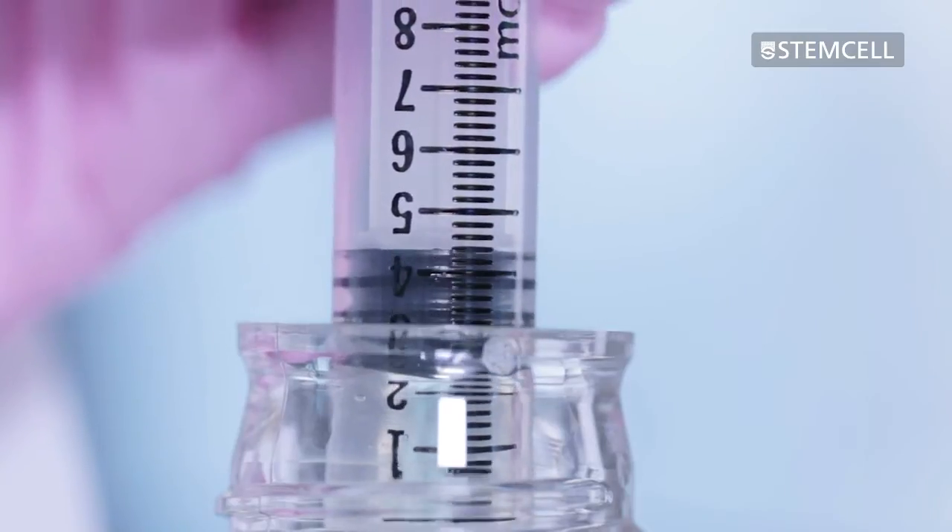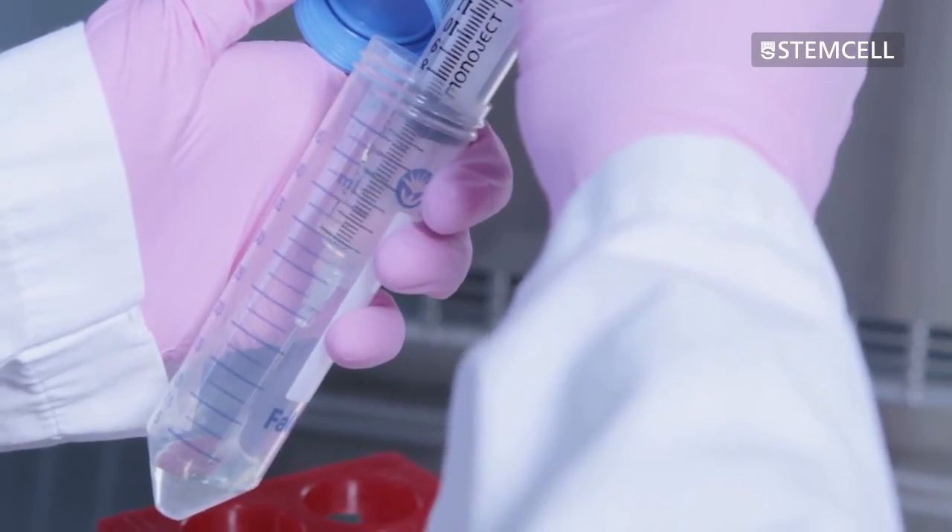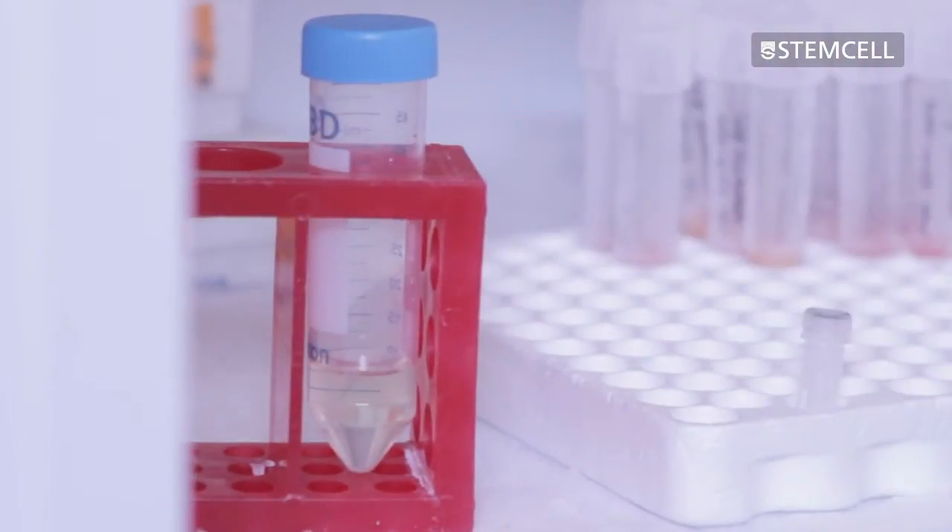Shake the bottle vigorously to mix the medium. If you do not need the whole bottle of semi-solid medium for your experiment, unneeded medium can be aliquoted and frozen for future use. This should be done prior to adding the cells.